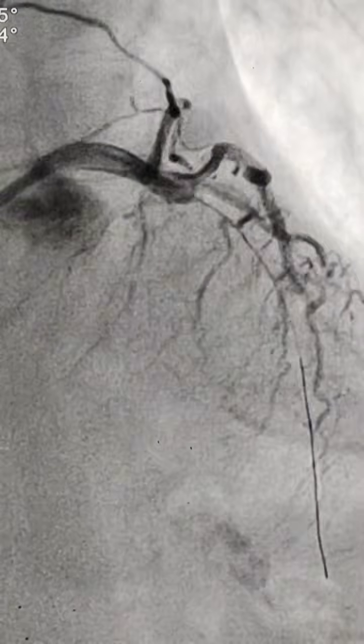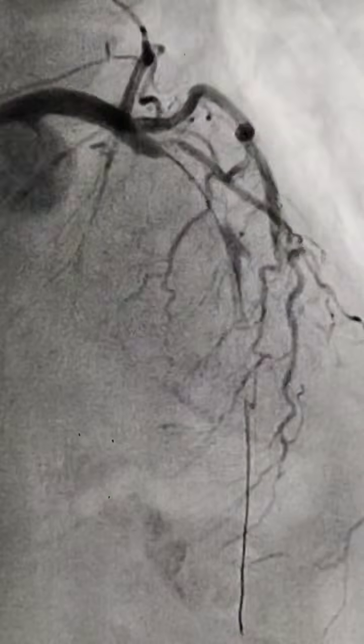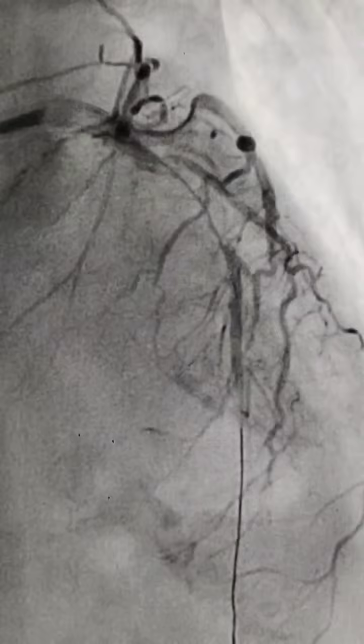Then again I did the balloon daughtering 3-4 times, and then I did multiple balloon dilatations sequentially in the LAD. This was a 2.5 balloon, and even after balloon dilatation there's no flow. You can see minimal flow is there. With all the tries we got flow. You can see the flow is there in the LAD, distal LAD.